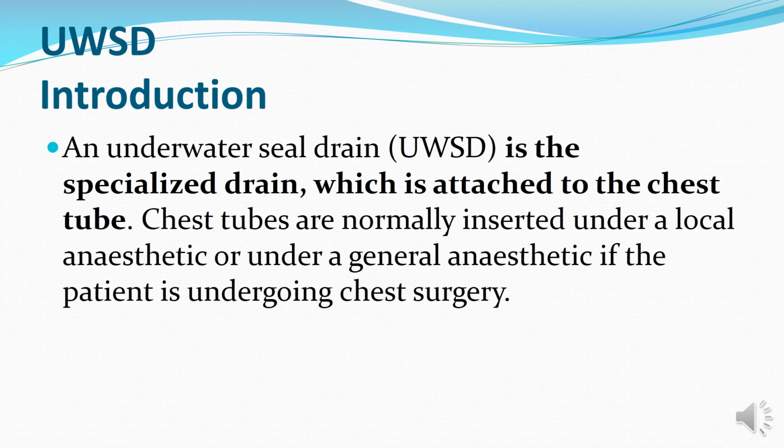Now, chest tubes are normally inserted under local or general anesthesia. You are making a cut on somebody's lung or thoracic cavity. Therefore, it's very painful. We are saying you should put the patient under local or general anesthesia.